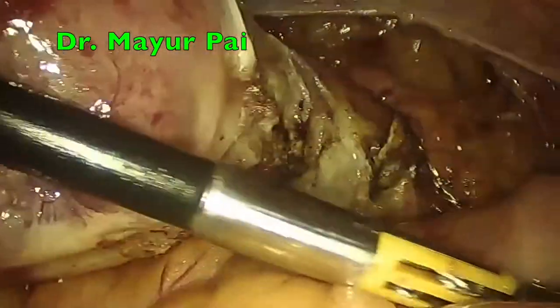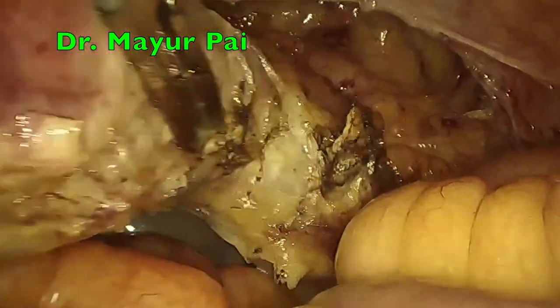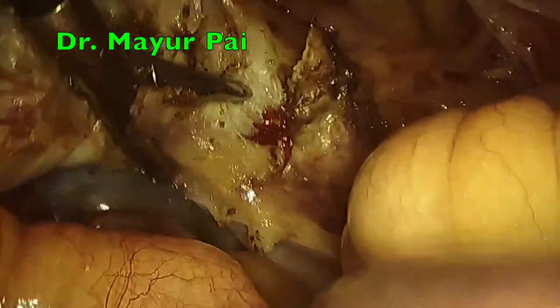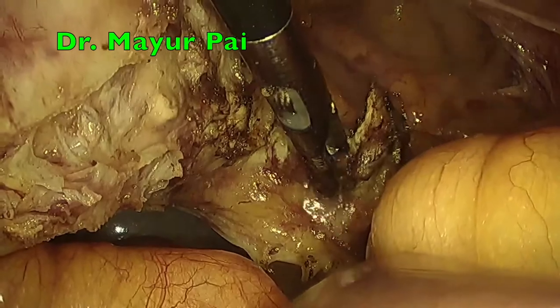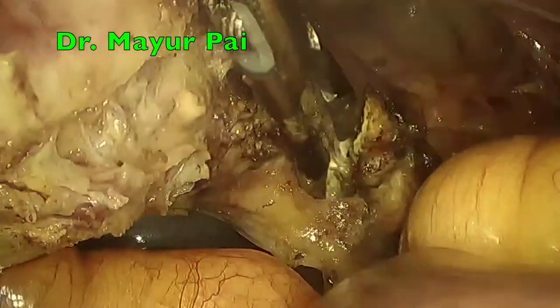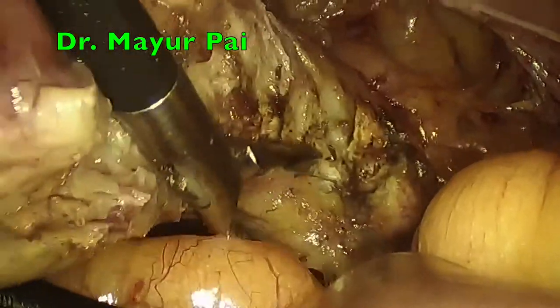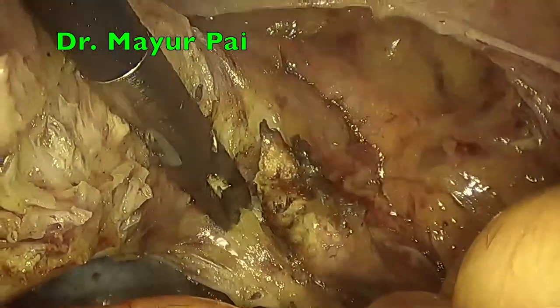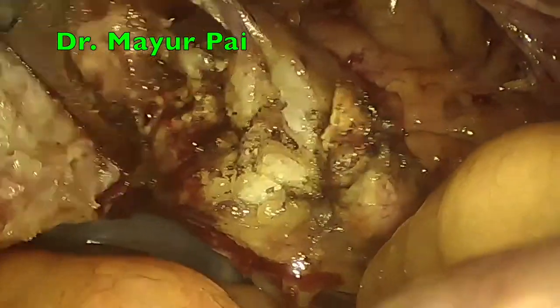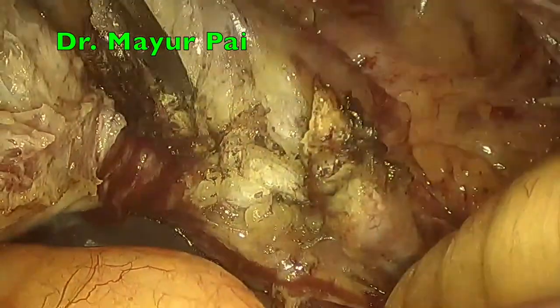The dissection always moves parallel and downwards from the cervix, along the cervix. Any bleeding that can occur can always be easily coagulated, as you can see on the screen. The bleeding that you can see is the backflow bleeding. Nothing requires to be done.